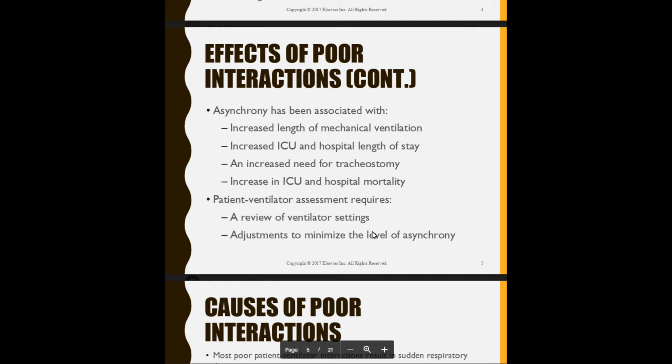Not you per se, but your actions or your lack of knowledge has led to an innocent patient who should have been off the ventilator a long time ago, but still intubated and vented because you caused this asynchrony, and now they have to get a tracheostomy. Shame on you.